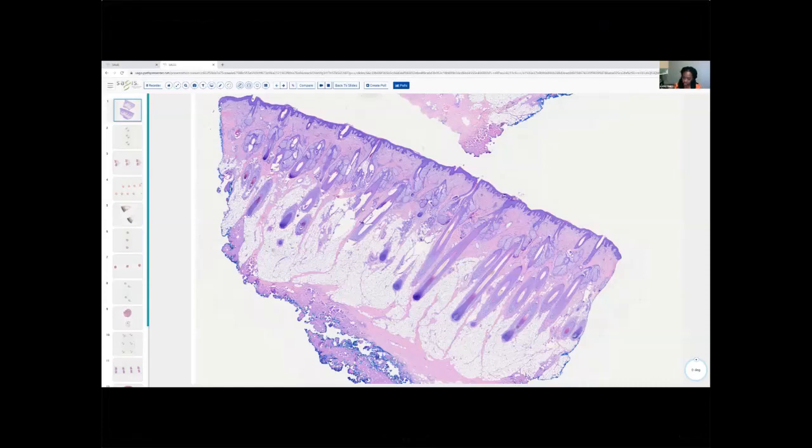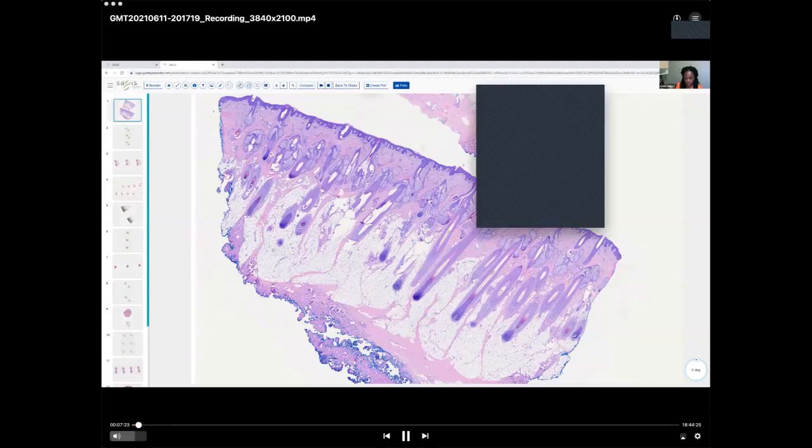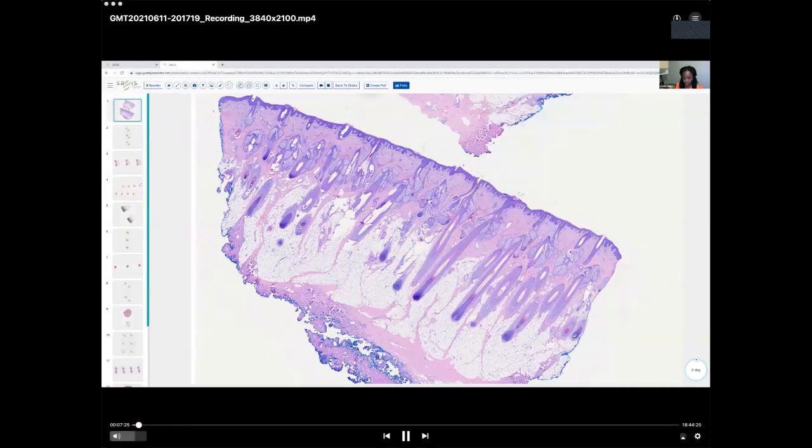When you're looking at things in cross section, you basically see all the follicles that are represented at that level in your biopsy. And so of course, it's giving you quite a wealth of information. And then just to finish up on this introductory slide, we like to standardize things, right? It helps to compare one case to another.